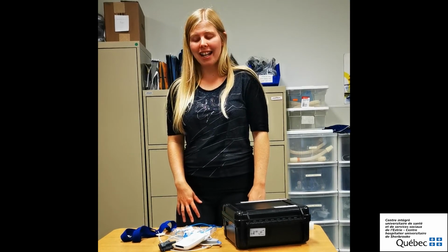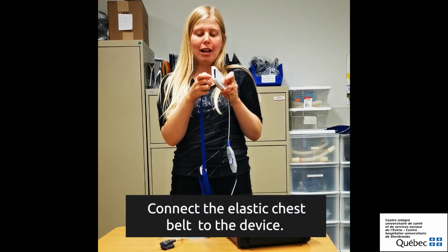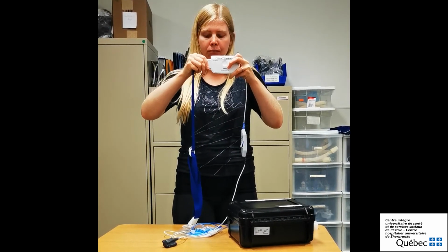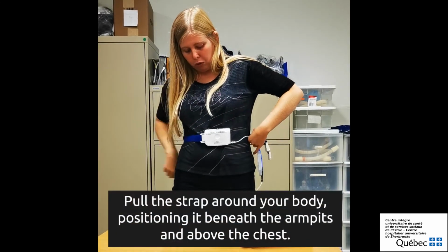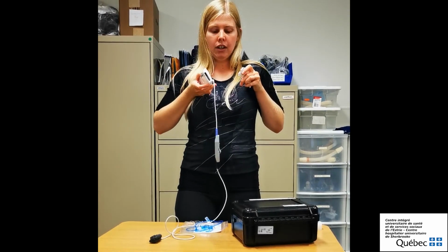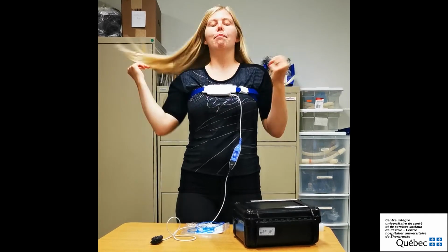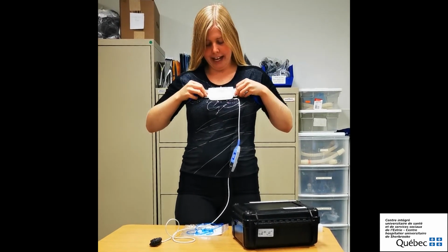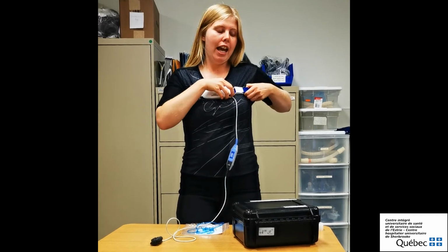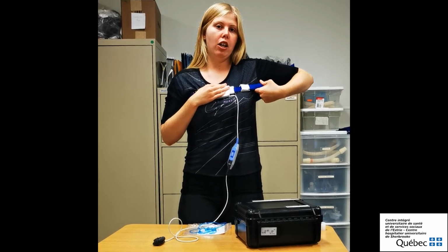To install the machine, you need to connect the chest belt to both sides of the machine, paying close attention that the top clip and the bottom clip are well inserted inside the machine. Next, we take the belt and put it around our armpits and over our chest. We connect the other part of the belt on the other side of the machine, making sure it is well inserted too. The machine will turn on automatically by itself. If you are having trouble getting a green light for the picture of the man with a chest belt, make sure the belt is tight enough around your chest so it can detect every time your chest expands when you breathe.